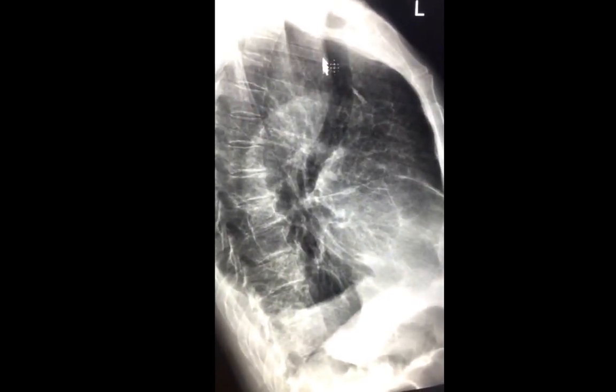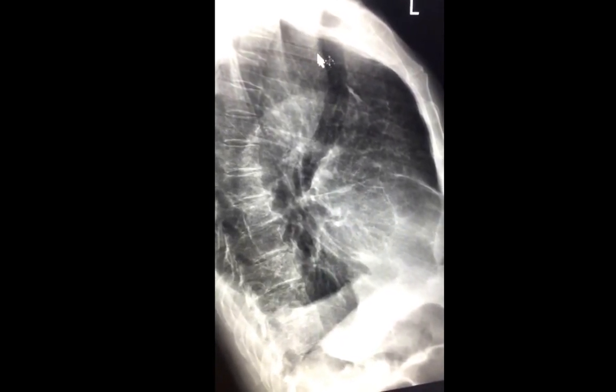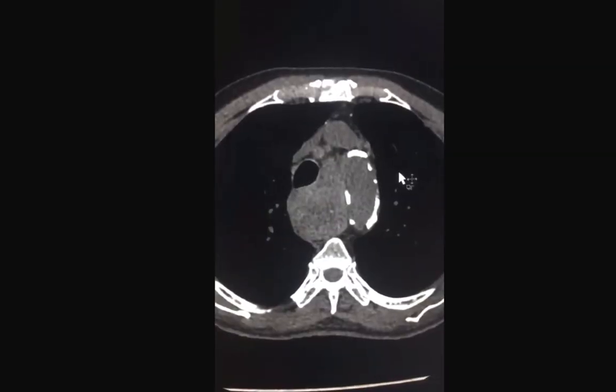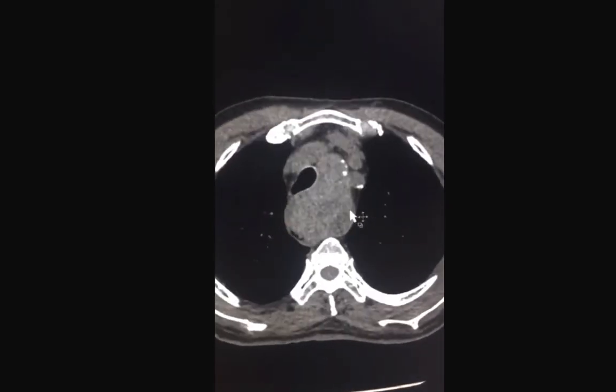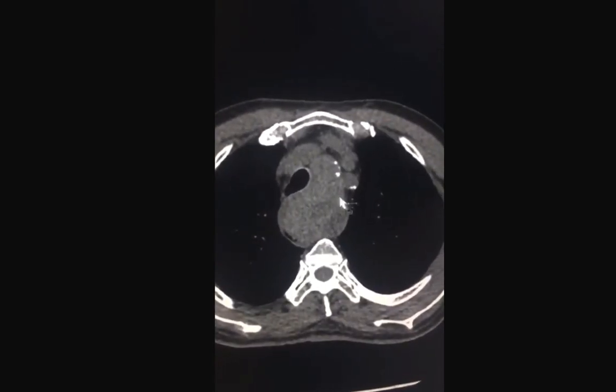We also had a quick discussion about the retrotracheal space and lesions that may occur there. So the big categories here are tracheal, esophageal, vascular, bone, lymph nodes, and descending from above. A neat teaching point from the CT scan as well is that thyroid extension is not necessarily anterior, it could be posterior to the trachea.